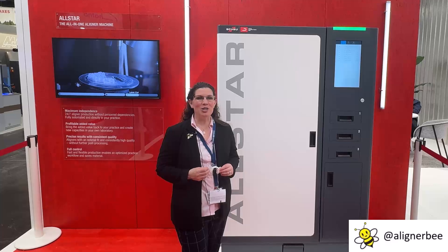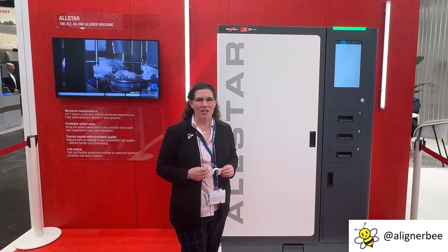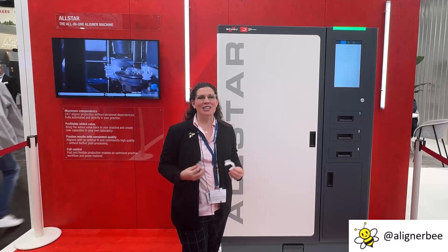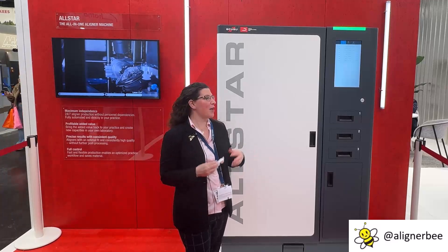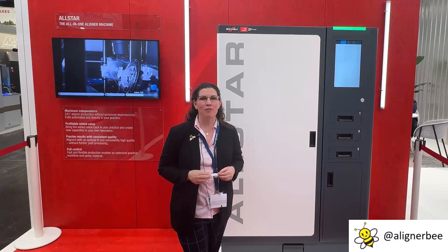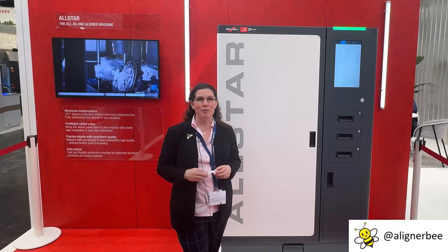Hi, this is Dr. Melissa Chotel, and I'm here at IDS 2025 in Cologne, Germany, and I'm standing in this Scheu booth in front of a really, really neat piece of automation for the dental laboratory and clear aligner space.